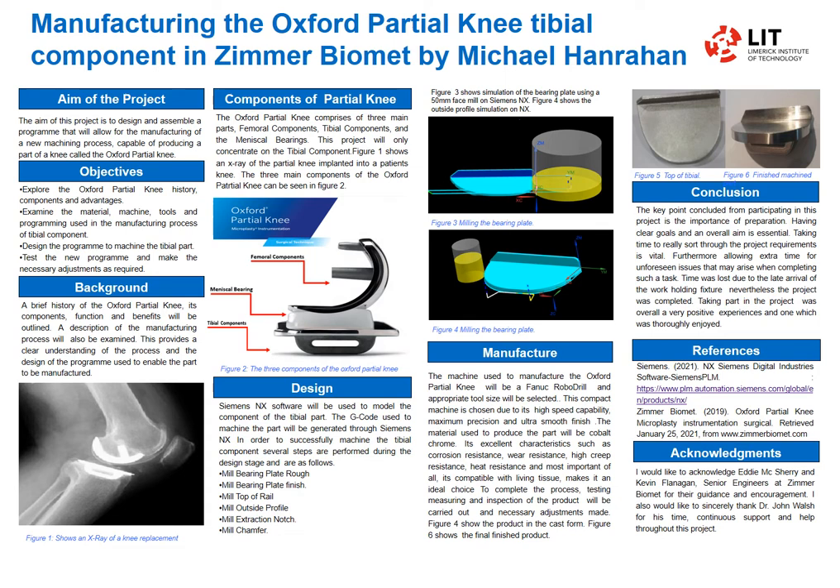The part was manufactured on a FANUC machine here in the factory. All the tooling and fixtures were new, so it was all basically done from scratch.